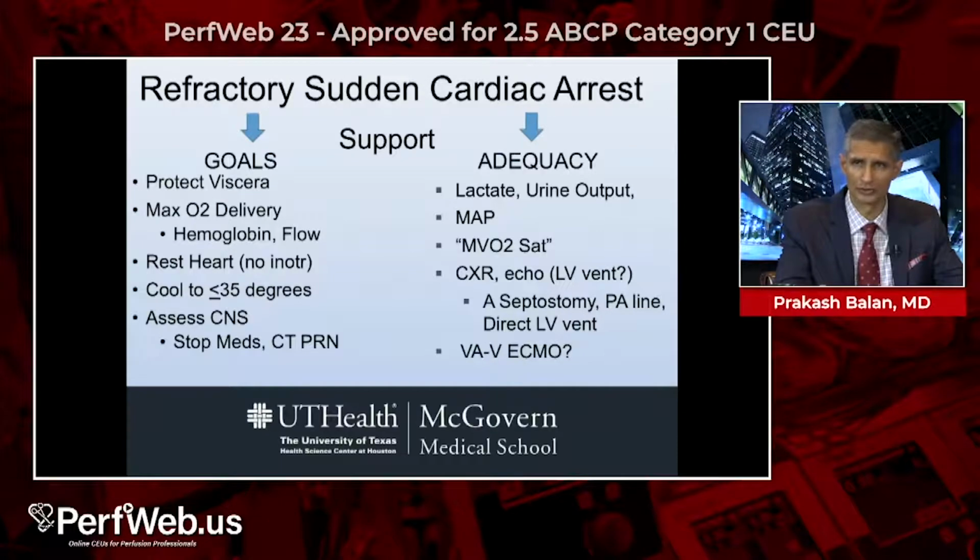So your goals with ECMO support, particularly in the setting of cardiac arrest and sudden hemodynamic collapse, is to protect the viscera, maximize oxygen delivery, rest the heart, come off of all of the inotropes, which are in many ways cardiotoxic agents, the dopamines, the epinephrines.